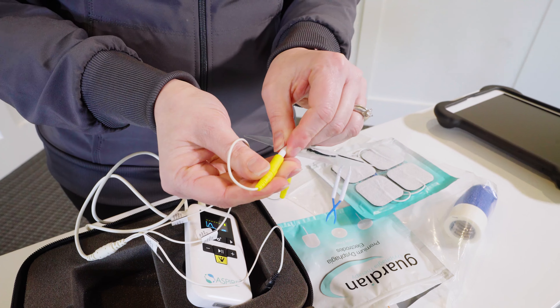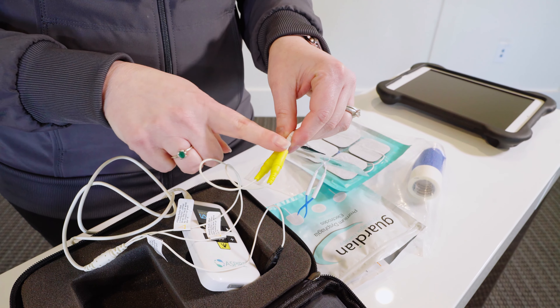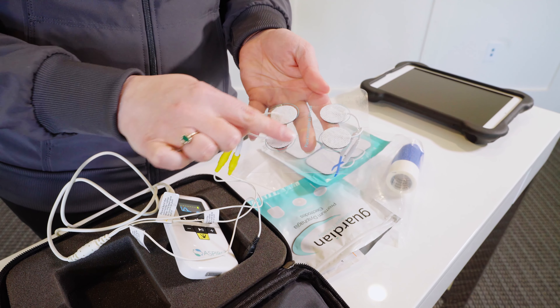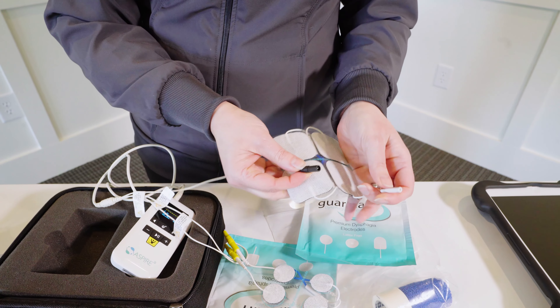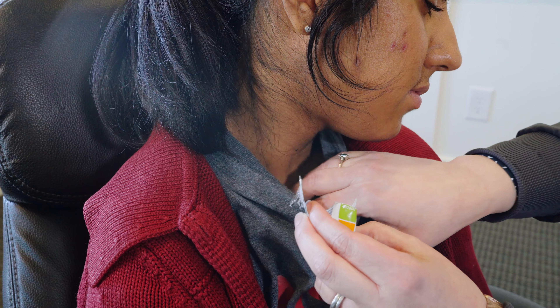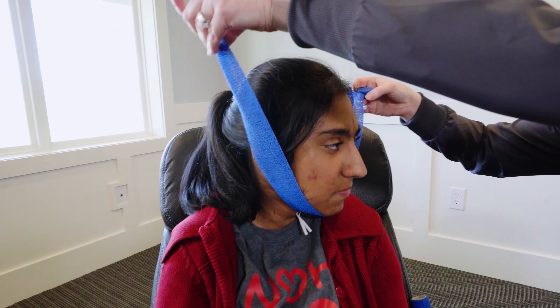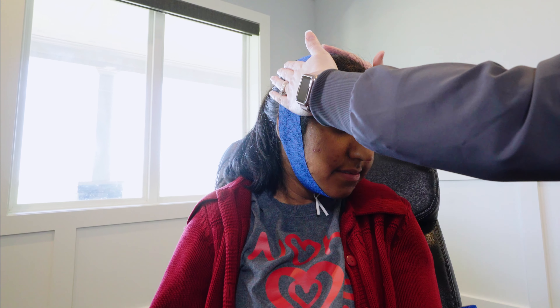The Aspire 2 device will give you a loose electrode signal if anything comes undone — whether that's the lead wire connection to the top of the device or the contact from the electrode to the skin. The black electrode is then going to plug into your square 2x2. Once you've prepped the skin and placed the electrodes, don't forget to use that adhesive bandage to make sure you have a good tight connection when getting a reading from your suprahyoids.